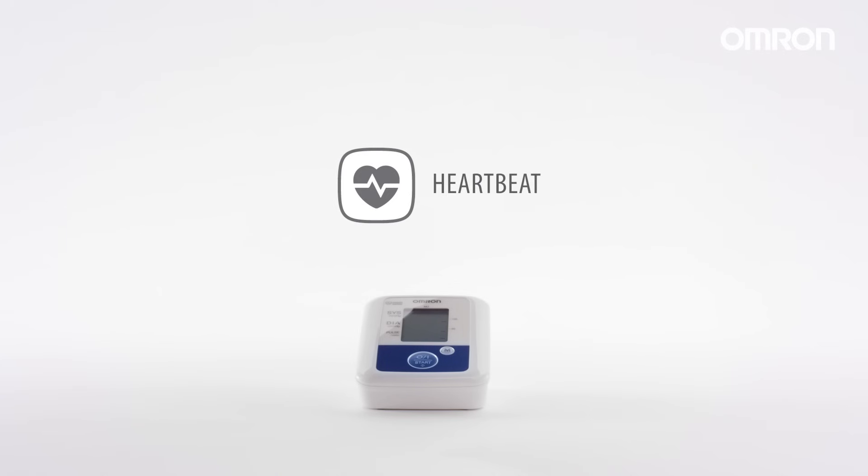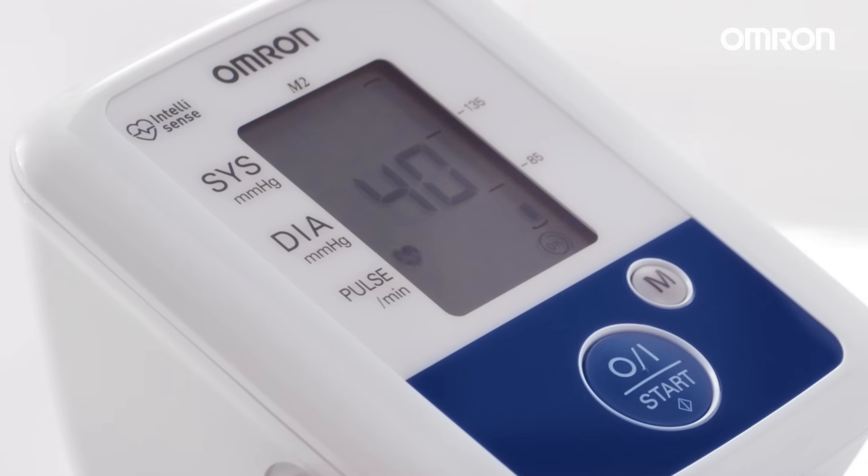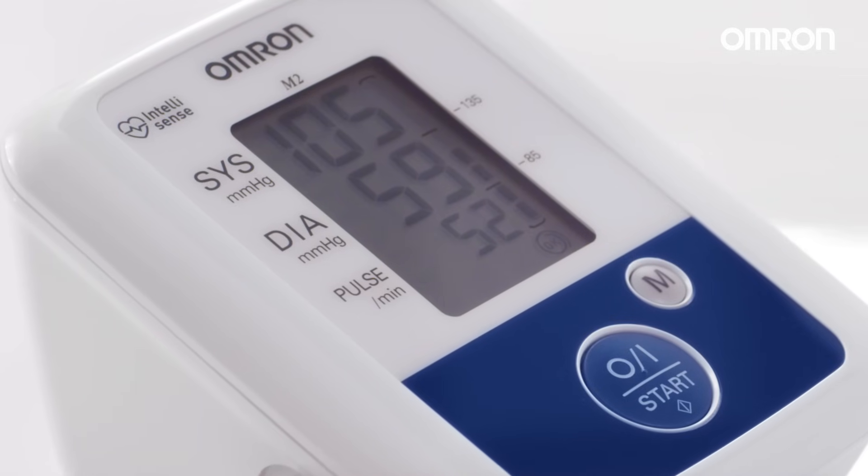If an irregular heartbeat is detected, an indicator icon will appear to alert you so you can consult with your medical professional. The presence of an irregular heartbeat can negatively affect the accuracy of a reading.